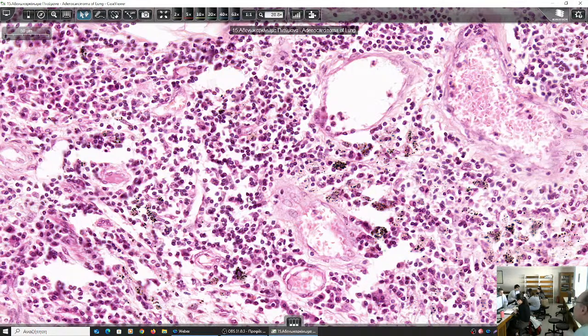However, these cells are not neutrophils. Which cells are they? Just a moment. Yes. Do they have cytoplasm? No. So they cannot be macrophages. They cannot be plasmacytes. What are they? They are the immune cells against cancerous tissue, lymphocytes. And which subsets of lymphocytes? T8 or natural killer cells are the main lymphocyte populations for destruction of cancer cells by the host organism.